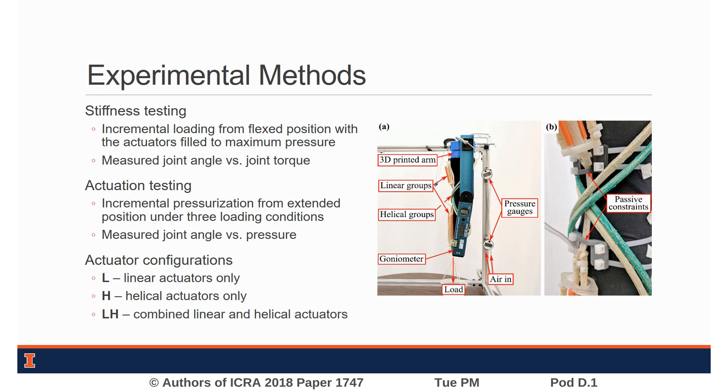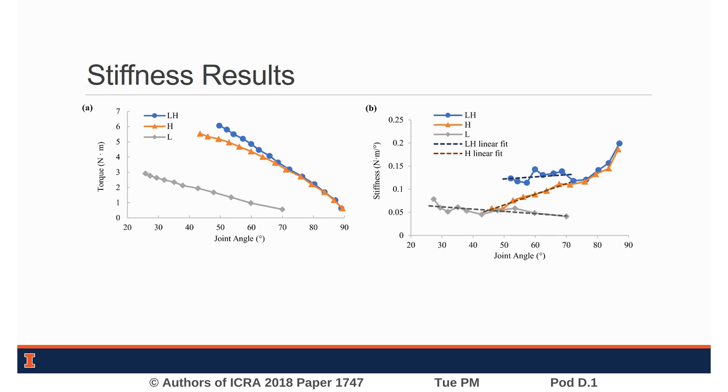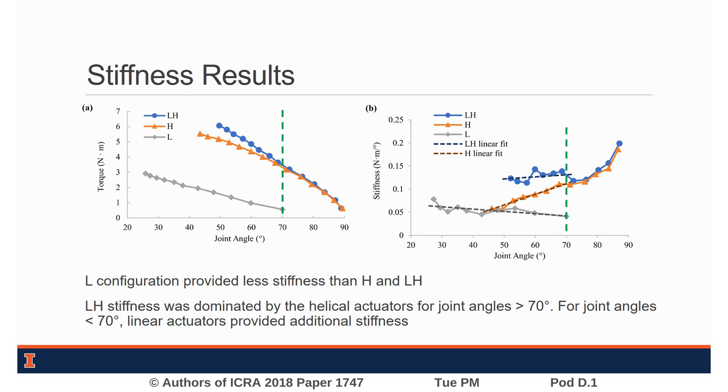We compared stiffness and actuation results for the linear and helical groups with a combined linear-helical configuration. We determined joint torque based on the loads and resultant joint angles from our stiffness test and calculated stiffness from these torque data. Helical actuators provided considerably more stiffness to the joint than linear actuators. Due to limited contraction length, the linear actuators only provided stiffness for joint angles below 70 degrees. Below this threshold, we can observe the contribution from the linear actuators to the combined configuration.